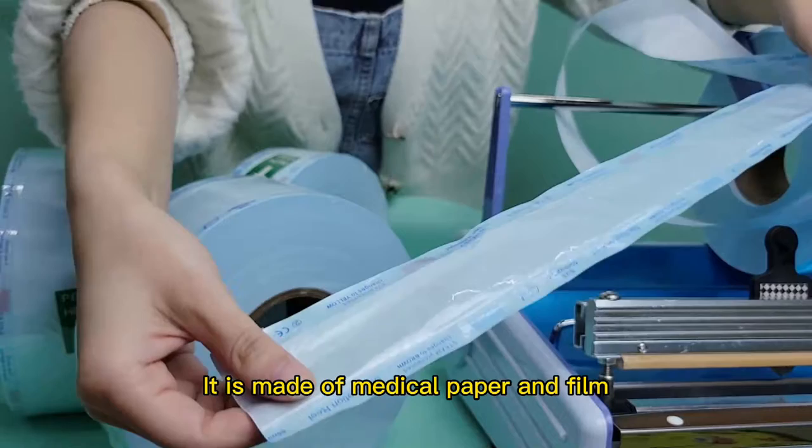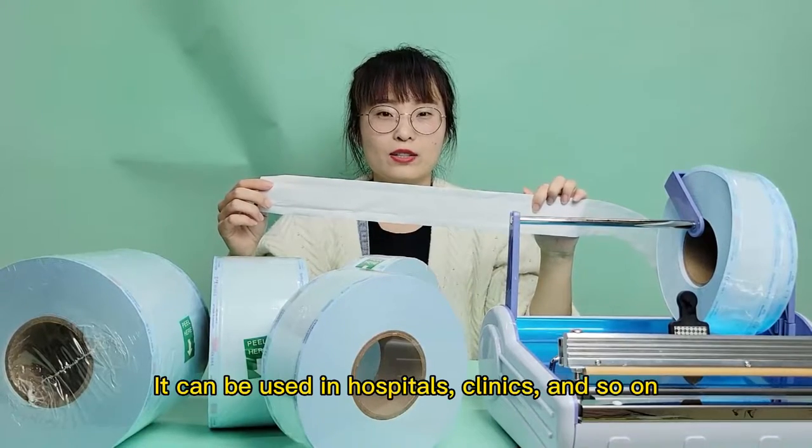It is made of medical paper and film, waterproof. It can be used in hospitals, clinics, and so on.